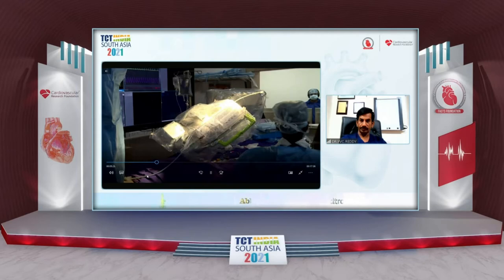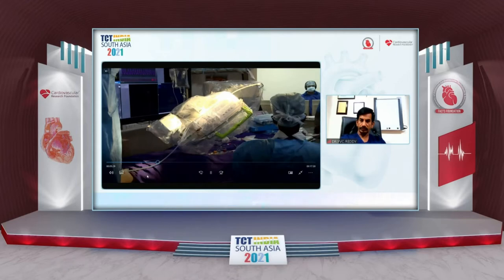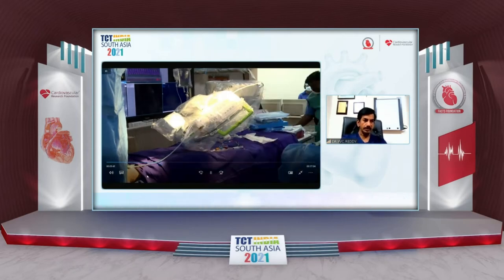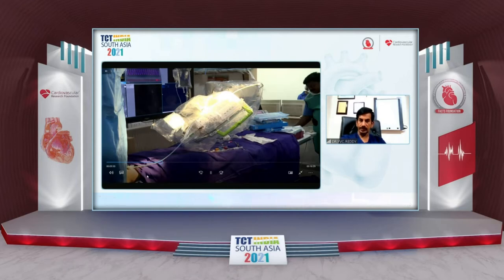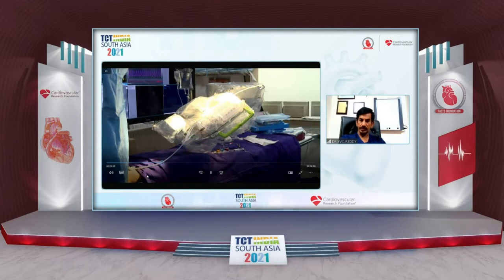a drive guide catheter console. A small shape was given to the pressure wire X guide wire and it was passed through the guide catheter Y connector till the distal tip of the guide catheter. And then the guide wire was put into the guide wire slot of the cassette and the cassette doors are closed. Then the robotic console is now ready for enabling.